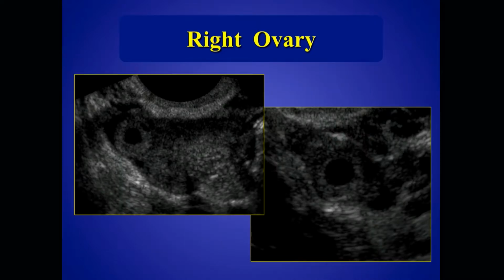And then we go over to the right adnexa, and here's the ovary. And then here we have what looks like some cystic mass projecting from the right ovary. And again, as with many of these cases, I'll ask you to pay attention to the echogenicity. I think that can be helpful. I will tell you in this particular case, I could not budge the cystic mass from the ovary. It looked like it was part of the ovary. Certainly ovarian tissue had a claw around this, so it looked like it was likely intraovarian.